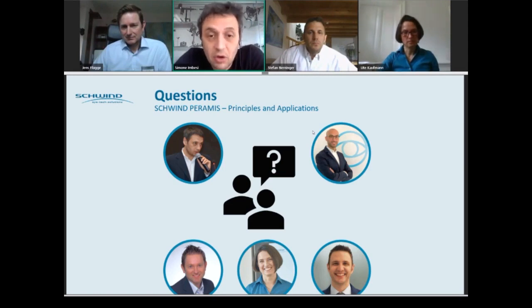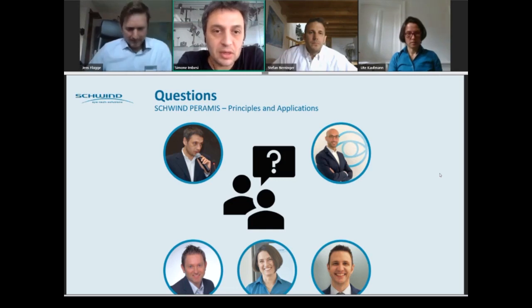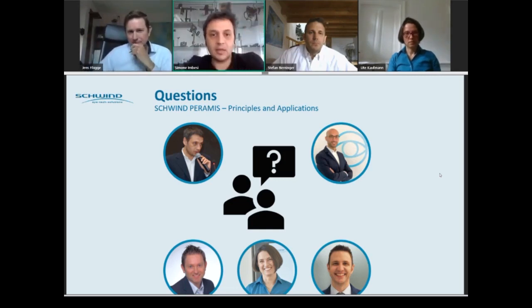The fixation of the first eye is not influenced in any case by the tilting of the chin rest, because the eye orients in the direction of the fixation point. The patient is asked to fix a light optically projected from infinity, so it doesn't matter what the position of the chin rest is. The eye always looks along the axis of the device.